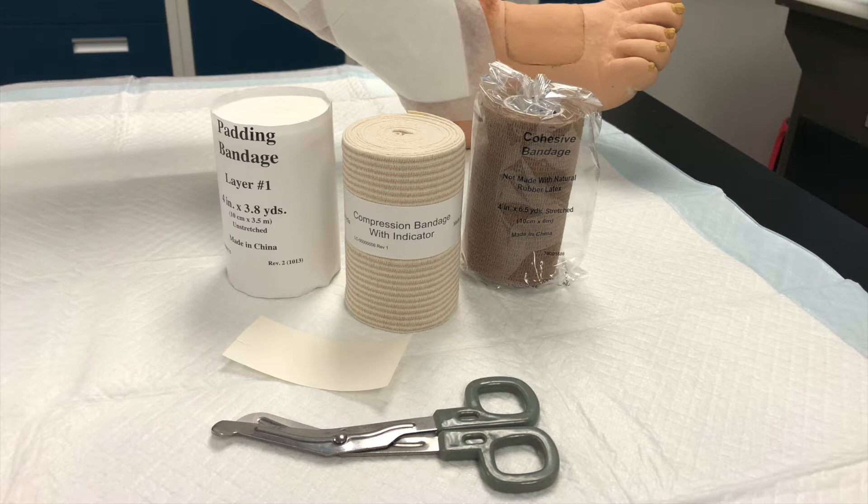3Press is not indicated for use on diabetic patients with small vessel disease, or on patients with an ankle brachial index of less than 0.8. Doppler ultrasound is recommended to rule out arterial disease.